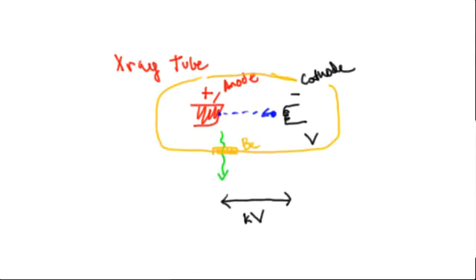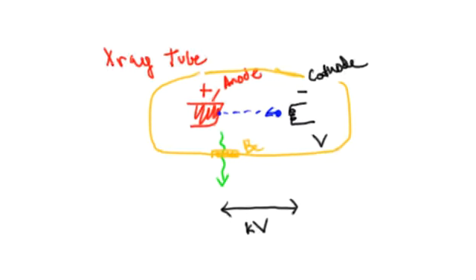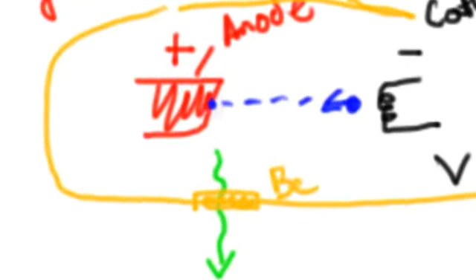Here we go. I'm going to start by talking about contrast. Let me start by drawing a source here. You'll remember what the source looked like. That's an X-ray tube, and you can go back to video 8.1 to review that. You have an electron accelerated towards an anode that produces a photon, and there's your source, the spot there, and it has some finite size.